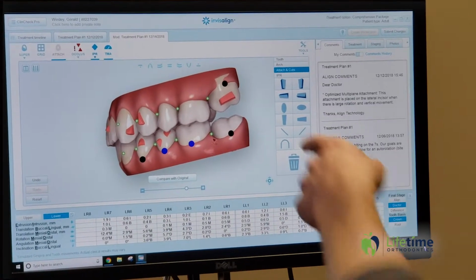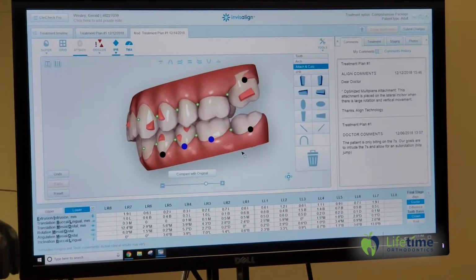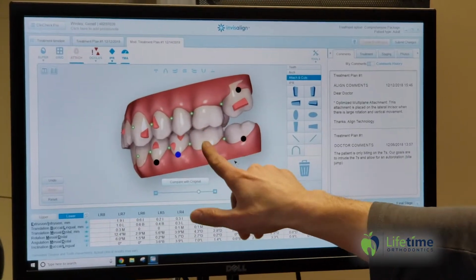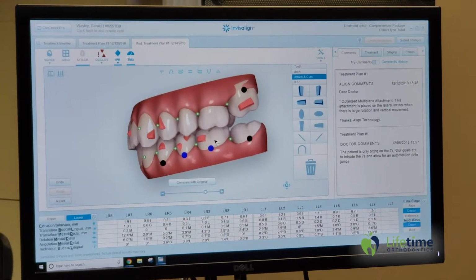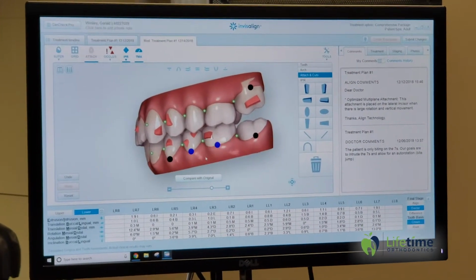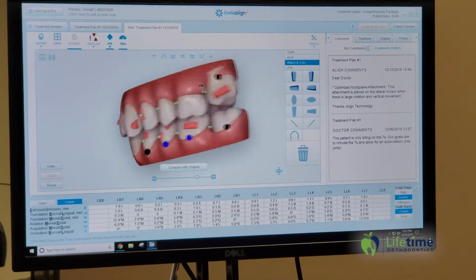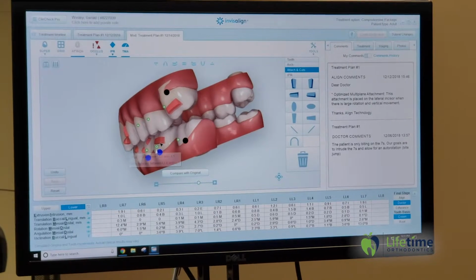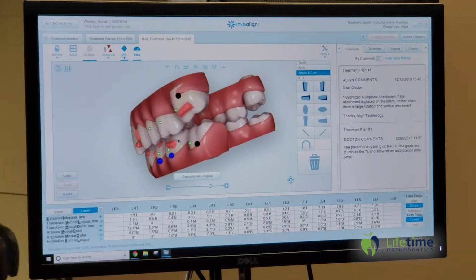Now here's another thing too. Now I want to push this tooth down. The plastic isn't just going to magically push that tooth down. It needs something to pull off of. So I want to hold this tooth in place. So to hold that tooth in place, I'm going to put an attachment here. And I don't want to mess around, so I'm going to put a big attachment. I want it to grip well, and I'm going to bevel it so it creates another little kind of undercut here, okay? Right there. You see that?